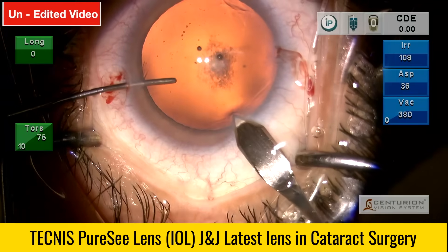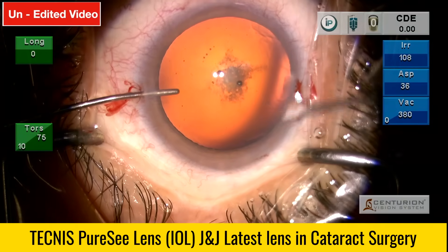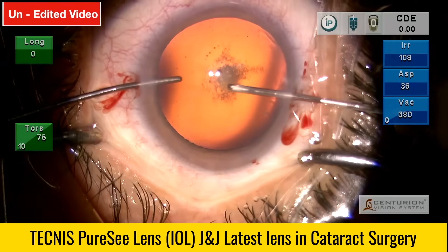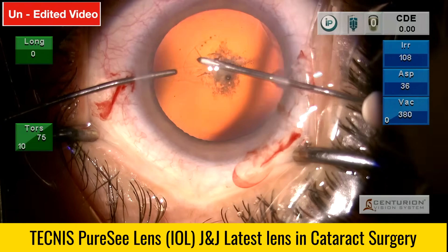The opening at the moment is 2.2 mm, but later I will expand it to 2.8 mm because I'll be using the pre-loaded system of the PureC IOL. They also have a separate cartridge that allows insertion through a 2.2 mm opening.